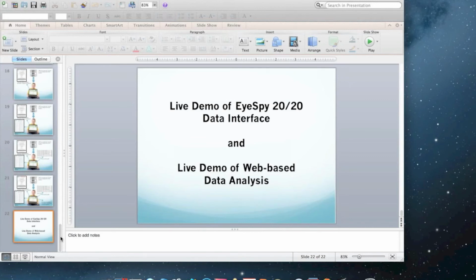It doesn't have to necessarily be anything that's happening at the state level, but internally, that's an important piece of the architecture for us to have doctors identify which child they are referencing in the system, as opposed to just saying John Smith with this date of birth, because we want to make sure that there's no confusion of data.